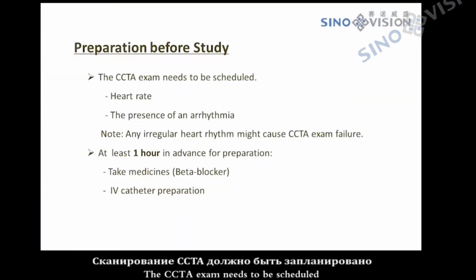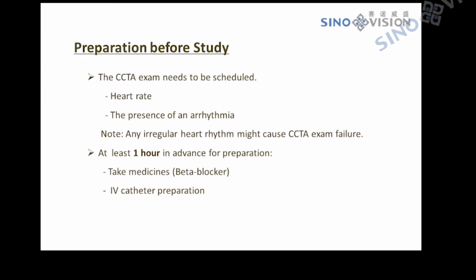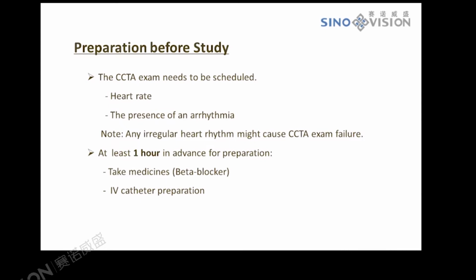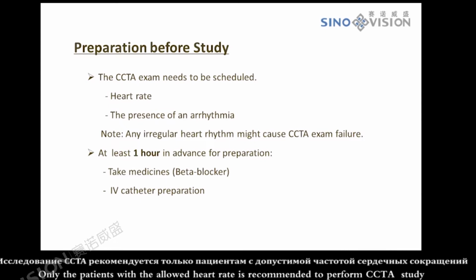The CCTA exam needs to be scheduled. The information about the patient's heart rate and the presence of an arrhythmia should be known in advance. Only patients with an allowed heart rate are recommended to undergo a CCTA study.